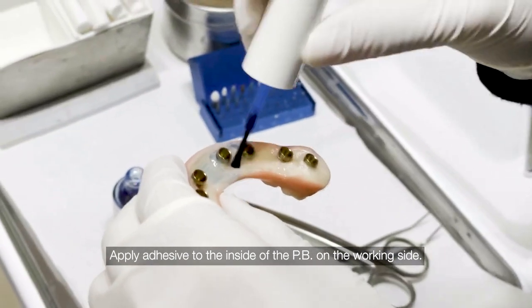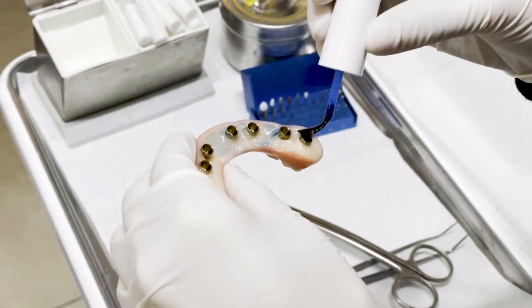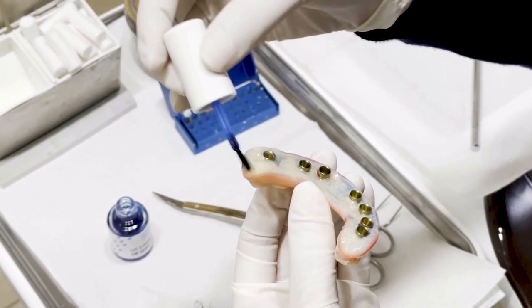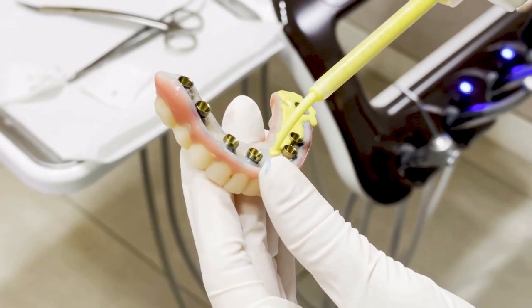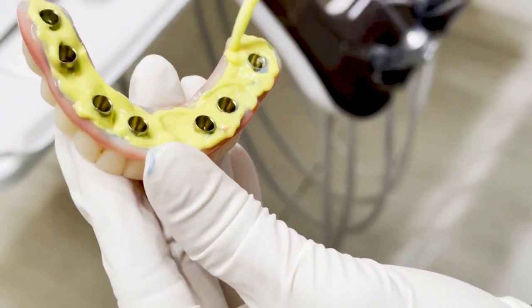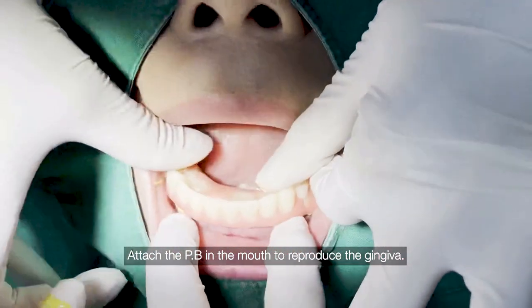Apply adhesive to the inside of the provisional bridge on the working side. The inner surface of the provisional bridge is re-lined with rubber. Attach the provisional bridge in the mouth to reproduce the gingiva.